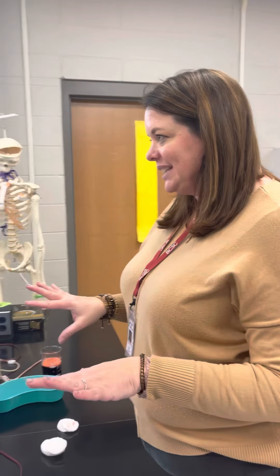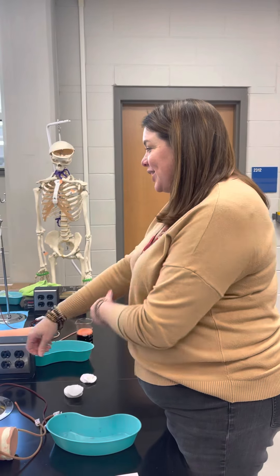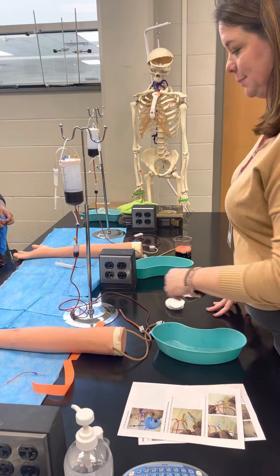Don't put your gloves on yet. Everyone has their own pair of gloves, but first I'm going to have you practice tying the tourniquet, because tying the tourniquet is really one of the trickiest parts.